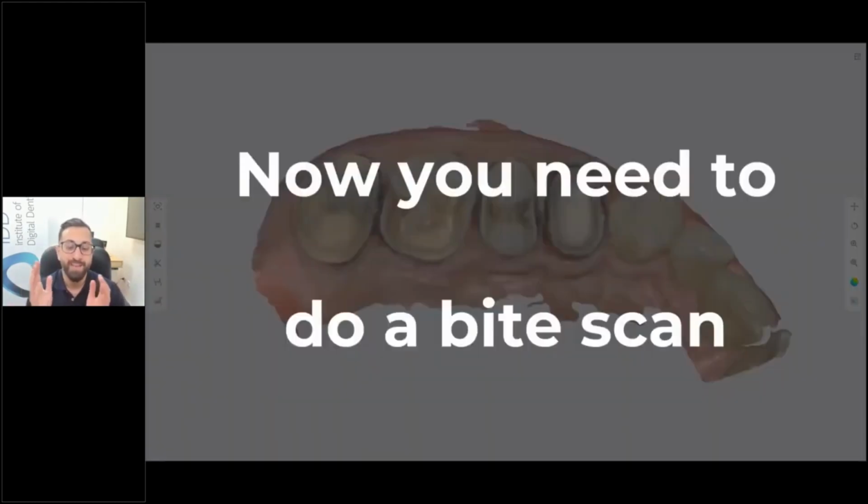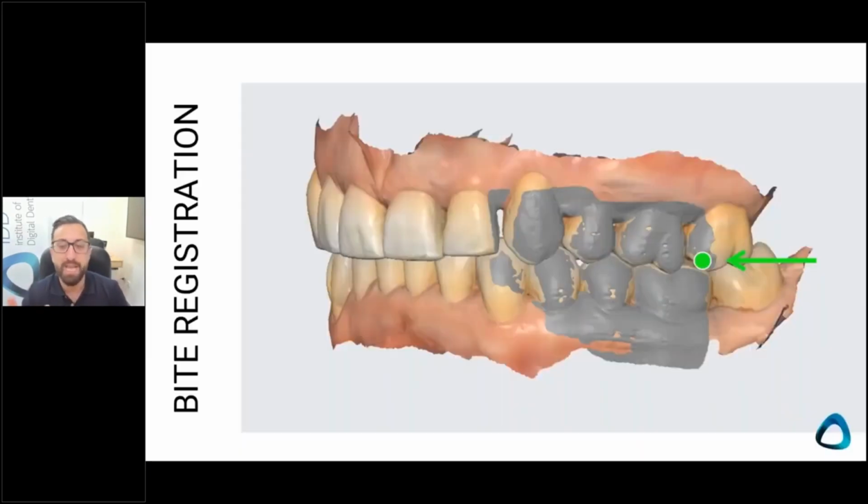So now you need to do a bite scan. Now the bite scan is an interesting thing because a lot of users struggle with this, and I know Medit has invested a lot of time and money into their AI, and they've even released an occlusion app just to help users with this. So the bite scan is very straightforward.